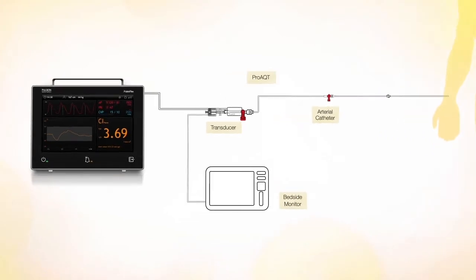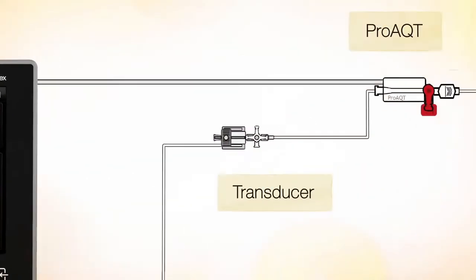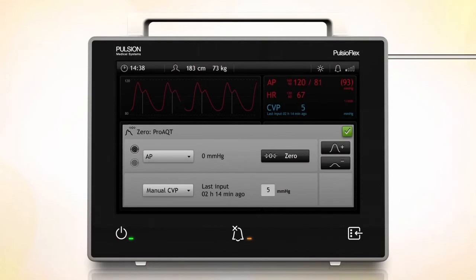To zero the pressure signal, tap the pressure curve area. Open the arterial system to atmosphere for zeroing. The baseline appears on the monitor. Tap the zero button.